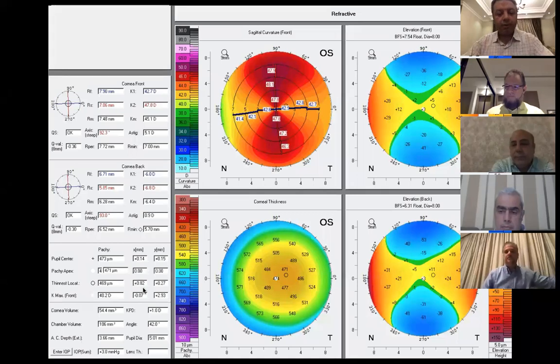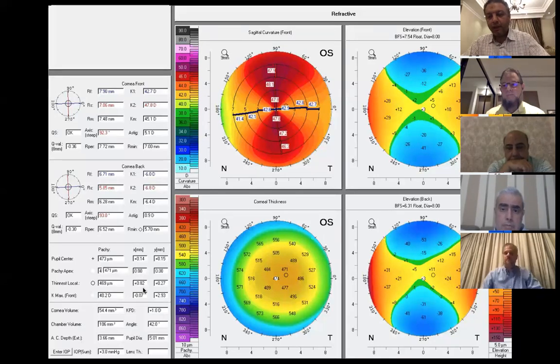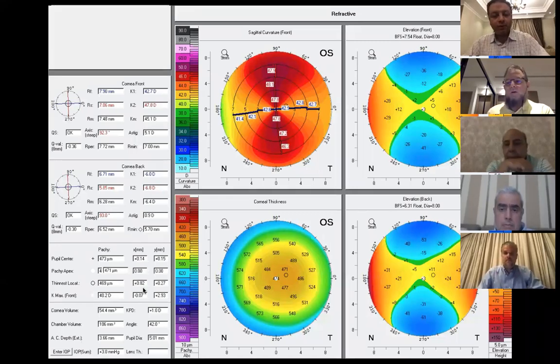Dr. Hossam, would you like to ask some questions from the audience? The same, sir, about the PRK. Okay, but I'd like to ask the same question of the participants or the audience about the customized ablation. Is it suitable in such a case or not? About the thickness, if we are thinking of customized ablation, I think we will choose the wavefront guided more than the topo guided. Sure. So is the thickness allowing such a procedure or not? This is my question, and from the audience too.